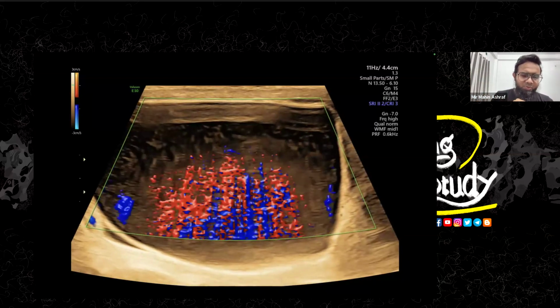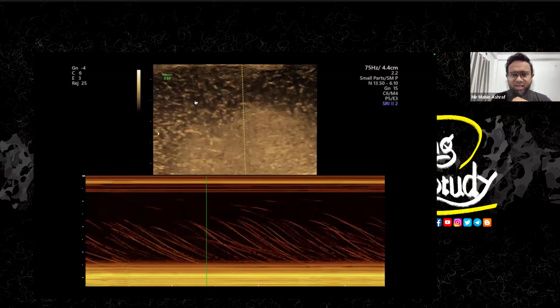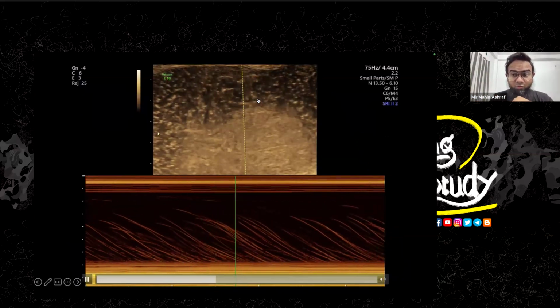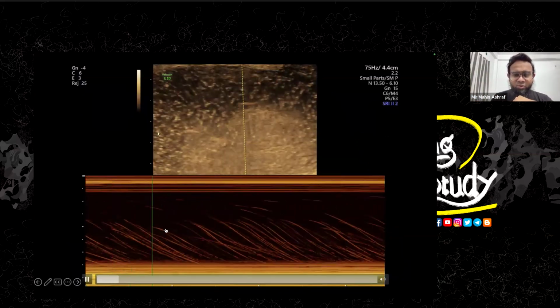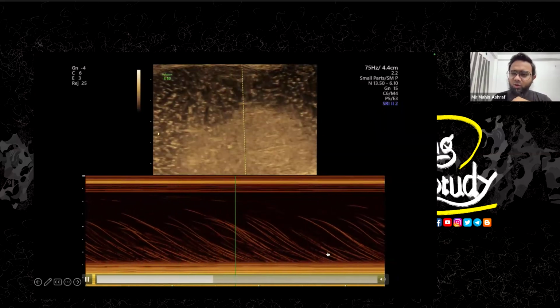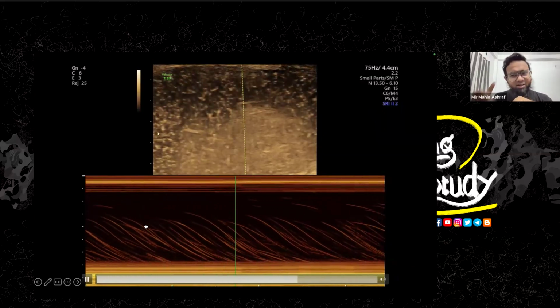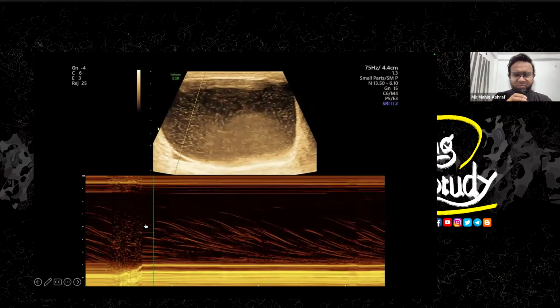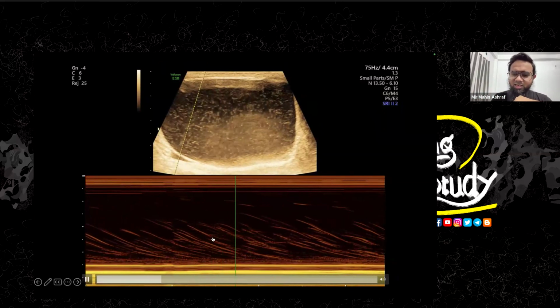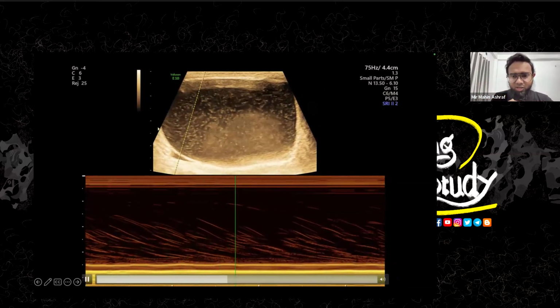It's a beautiful image. So here's the picture. You can see I have put M mode and there's the motion of the spermatozoa. You see the spermatozoa are moving, and the M mode will draw a beautiful picture for you showing the motion of the spermatozoa. Isn't it beautiful? Let's look at another picture. I have changed it from this part to here. Now you can still see these motions. It looks very beautiful, a very artistic picture.